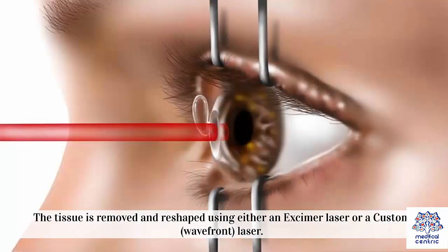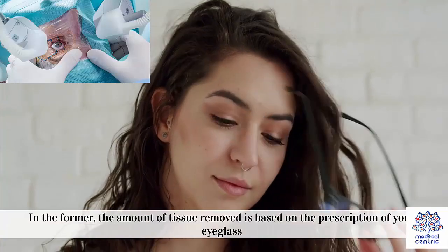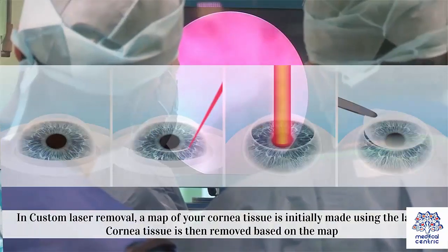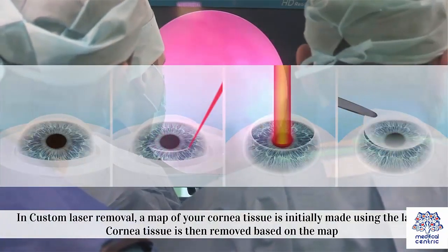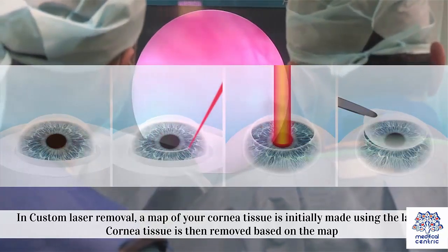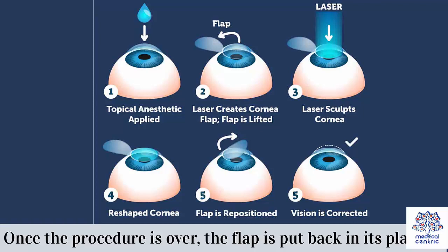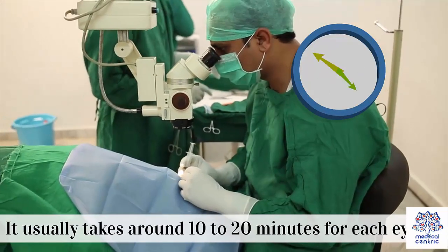The tissue is removed and reshaped using either an excimer laser or a custom wavefront laser. In the former, the amount of tissue removed is based on the prescription of your eyeglass. In custom laser removal, a map of your cornea tissue is initially made using the laser, and cornea tissue is then removed based on the map. Once the procedure is over, the flap is put back in its place. It usually takes around 10–20 minutes for each eye.